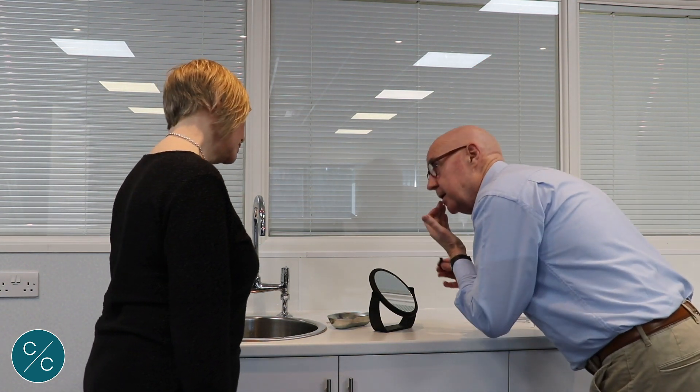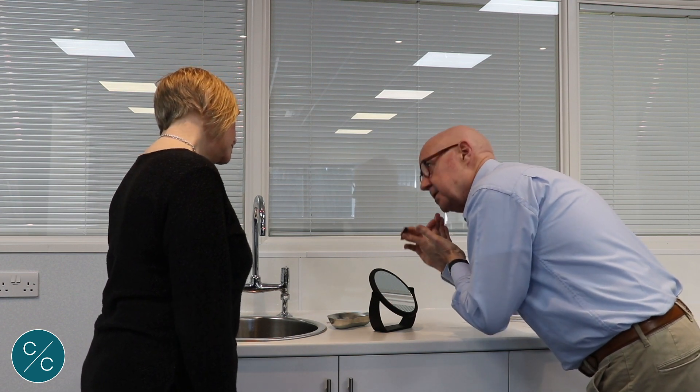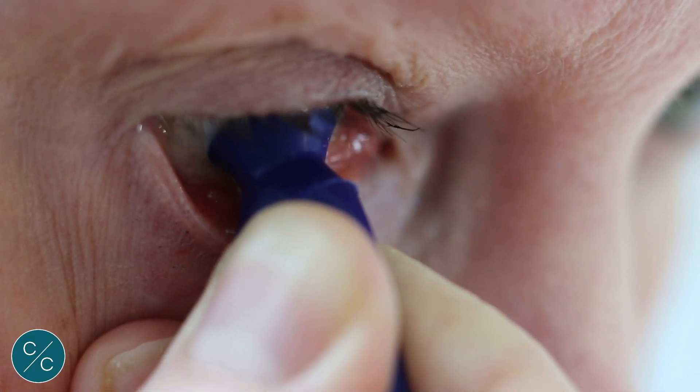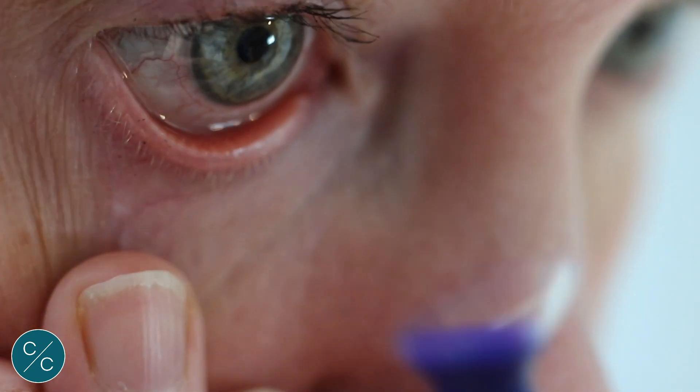We're going to lean forward, pull the lower lid down, make sure we can see the lens, press the sucker, expel the air, place the sucker against the lower half of the lens, release to get some suction, and then lift up and away.